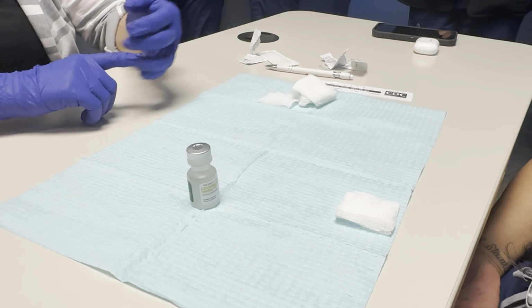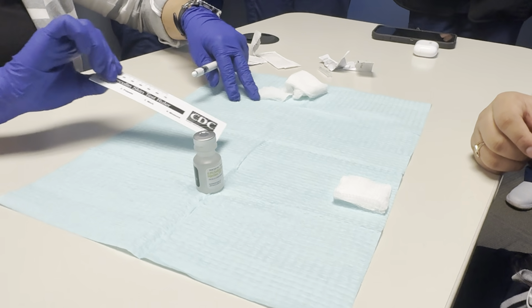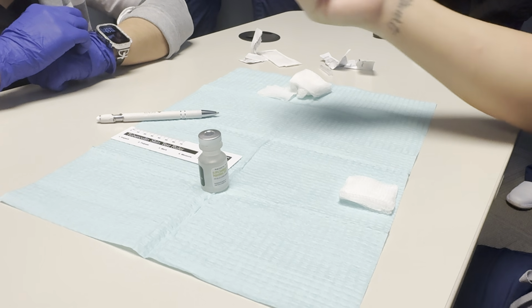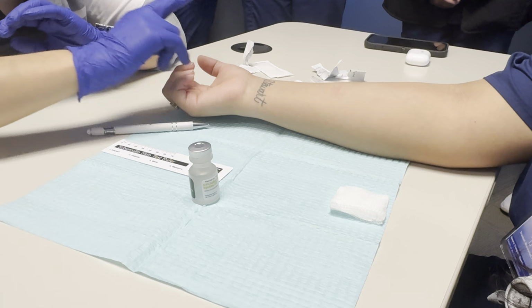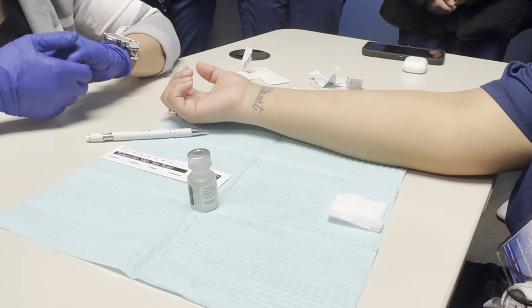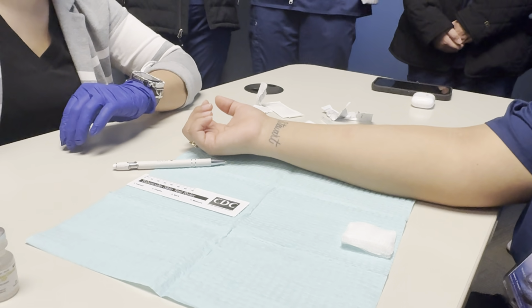We tell them that we're going to read. Since I do a reading, I'm going to go ahead and bring my pen and my ruler with me. All right, so we already introduced. We already confirmed. May I please see your arm? Perfect. Now, this process, what I'm going to do, I'm just going to look at your arm, and then I'm going to touch your arm, which is palpation. And then we're going to measure that, and then we'll let the provider know. Is that okay? Perfect.